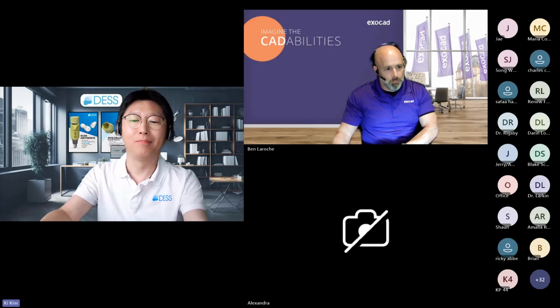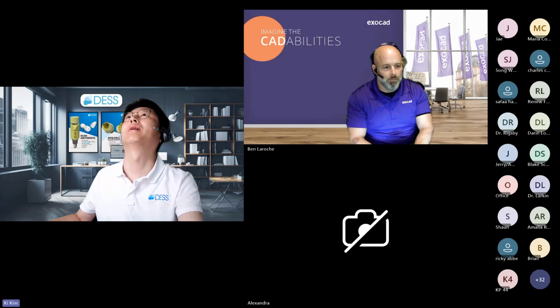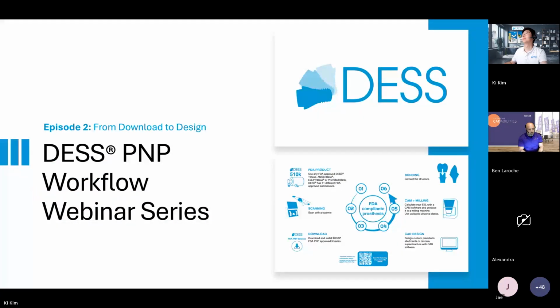All right, thank you. Hi, everyone. My name is Ki, and I want to share my screen first. Can you see my presentation, PPT? Okay. Yeah, thank you for joining today's webinar.